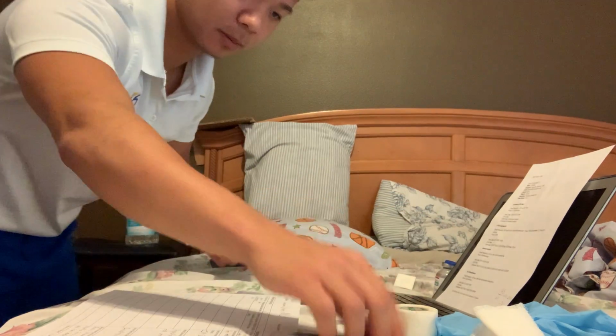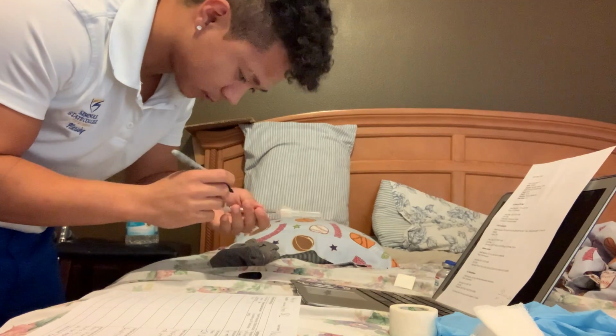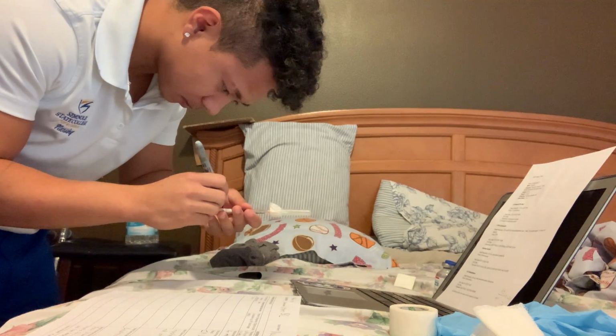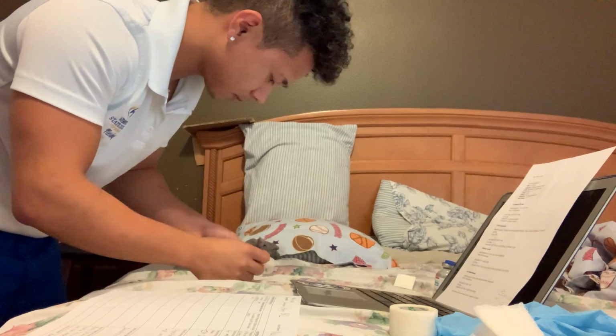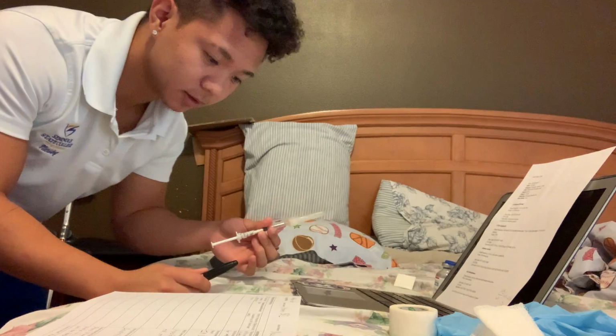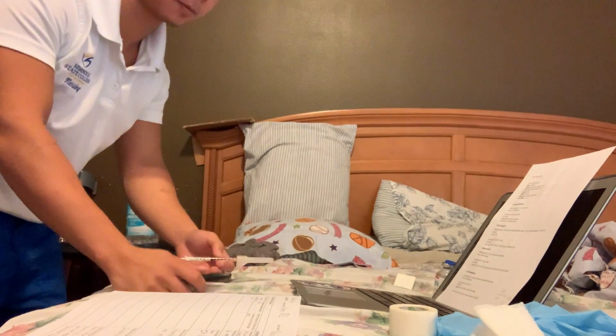And I would label the syringe with a barcode. And once I've labeled the syringe, I'm gonna go into my opening procedures.